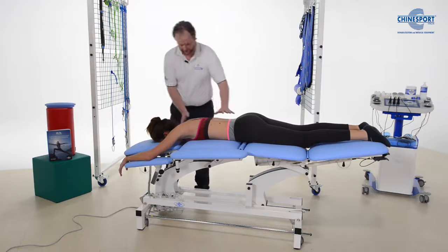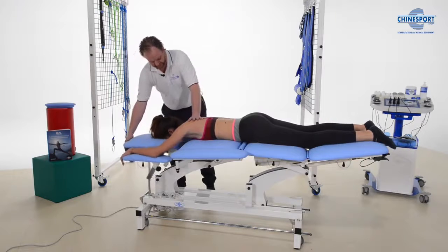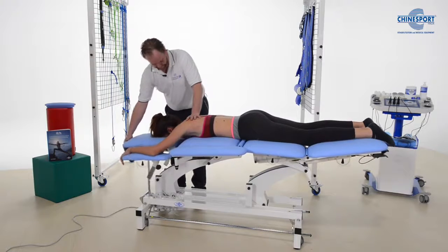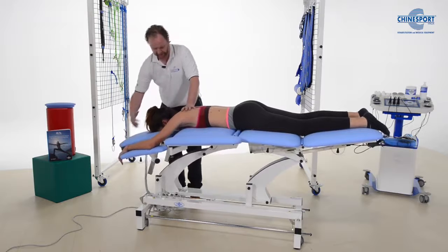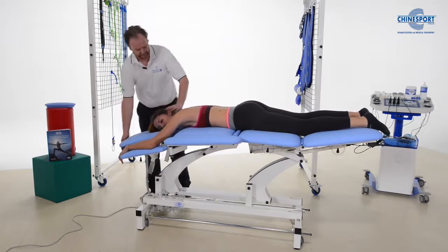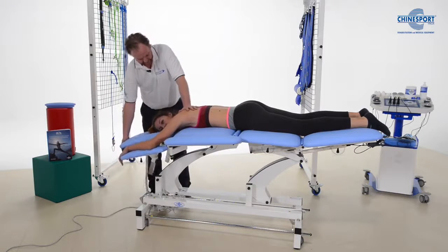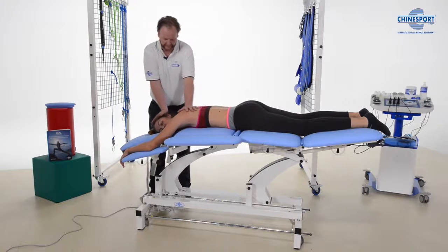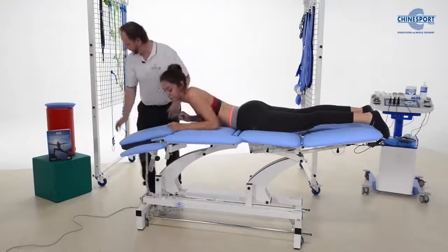We can also, if she moves down a little bit more, we can go into neck mobilizations. We can add some rotation. If she just looks towards one side, we can add some rotations. And we can add some stretching as well for the cervical musculature. There we go. Okay, you can turn around now.